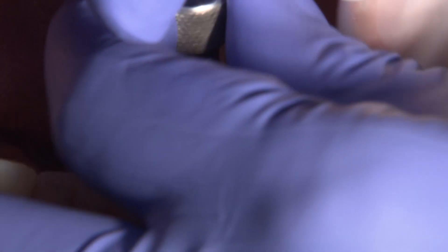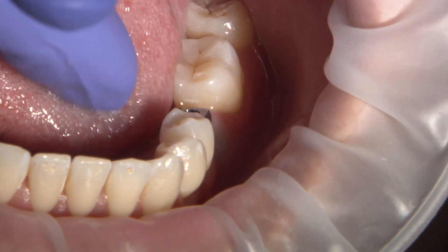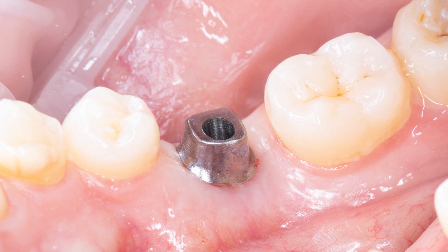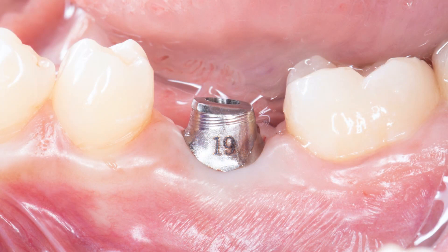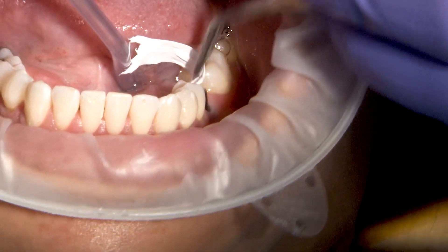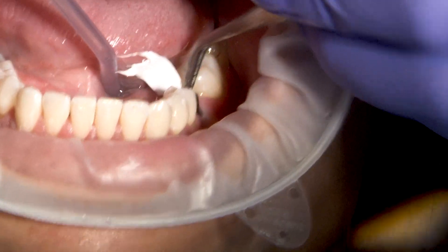There may be a situation where you find yourself needing to fabricate a restoration on an implant abutment that is already seated in the patient's mouth. Typically, this is much easier if it is a custom abutment and the margin placement is ideal. This is because when acquiring a scan on an implant abutment, it is important to identify and capture the margins of the abutment.